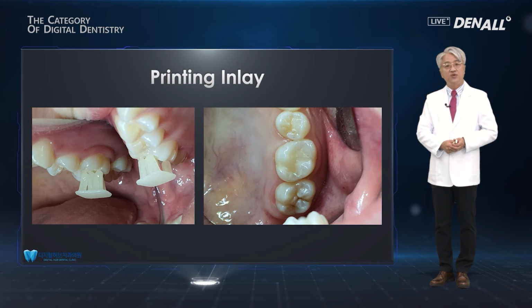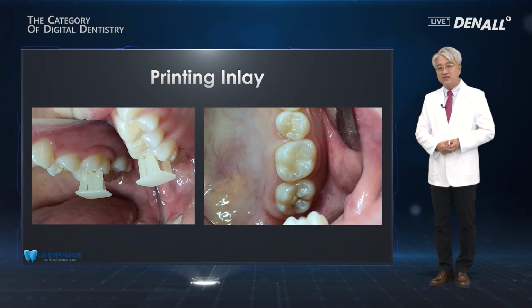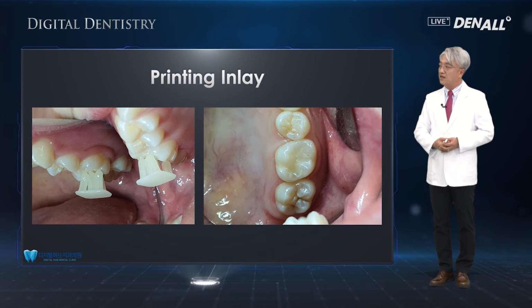Another thing is that 3D printers have become very popular, so we also use that a lot in connection with the inlay. And as you can see, we print the inlay and set it to the patients.